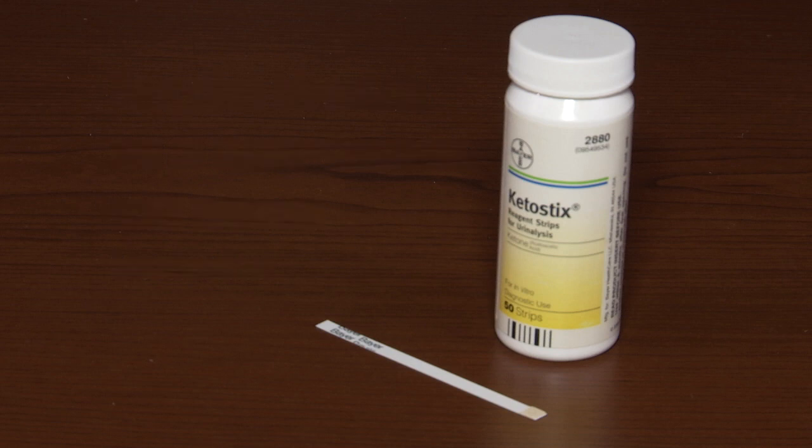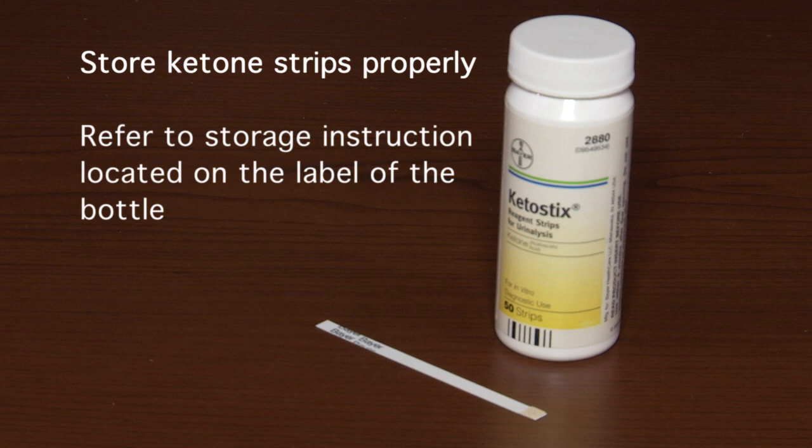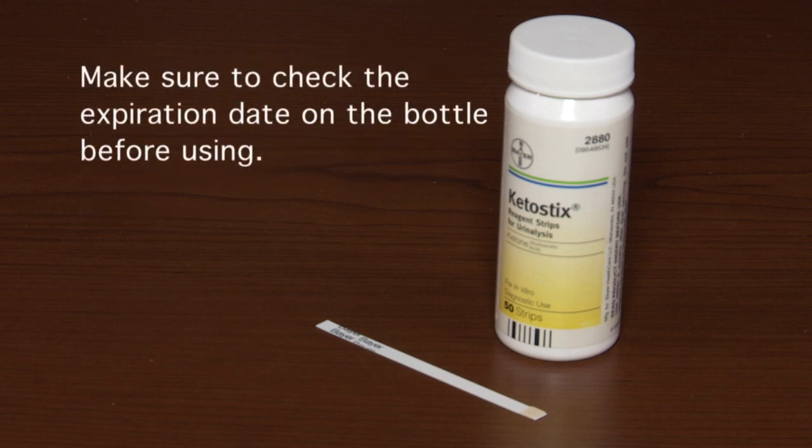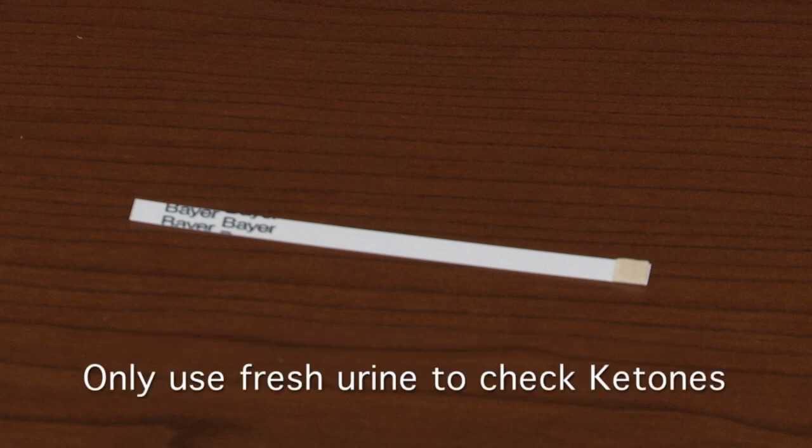It's important to properly store your ketone test strips. Please refer to the storage instructions located on the bottle of your test strips, and make sure to check the expiration date before using. Urine test strips are generally good for six months after opening the vial. Only use fresh urine to check ketones, and pay strict attention to the following instructions.